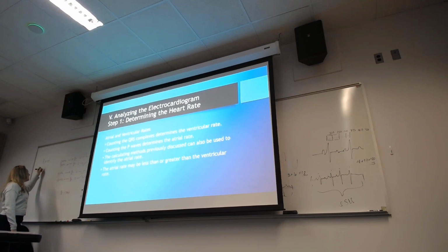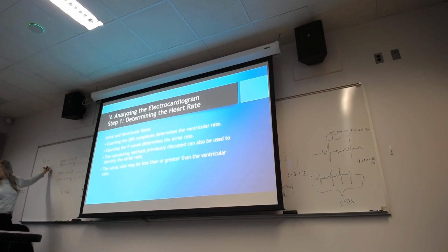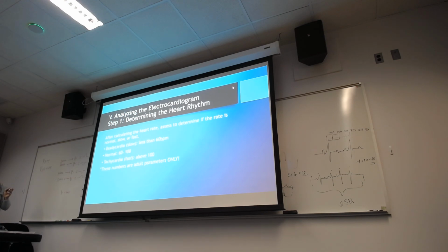Do they have one? Do they not have one? Right? Rhythm. So after you can say bradycardic, normal rate, or tachycardic, then you're going to look at the rhythm, and you're going to be like, is it regular or irregular?